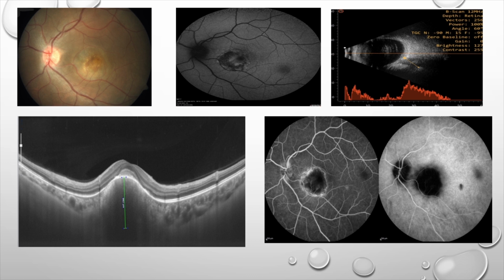How will it be? See, a hemangioma is a solid tumor, isn't it? So how will it be on an ultrasound? Would it have different surface and internal reflectivity, or would it be uniformly the same? The echogenicity on the ultrasound, how will it be? Because that is one way of picking up whether it is a hemangioma or not. And we are talking about a circumscribed hemangioma, not a diffuse one, because the differential here will not be a diffuse. It will be a circumscribed.